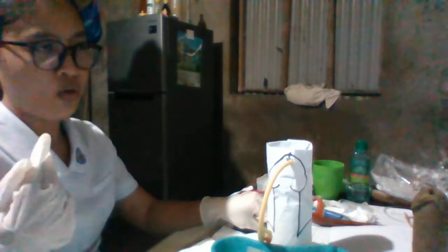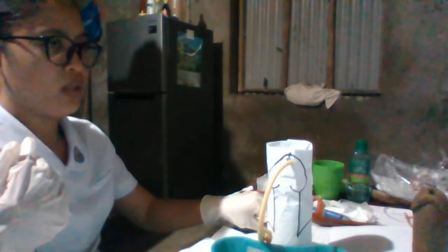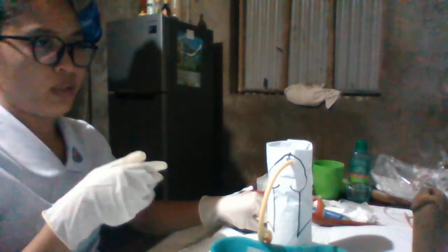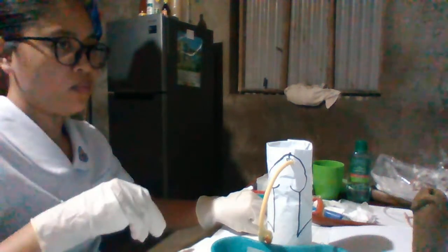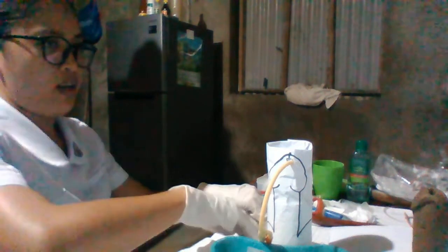We are going to tape the catheter tubing on top of the thigh or lower abdomen so that it will not slack easily or move when the client is moving, or any movement to detach it or to touch the tube. So it will not create distress. Then be sure that there are no obstructions or kinks in the tubing. So we're going to tape.